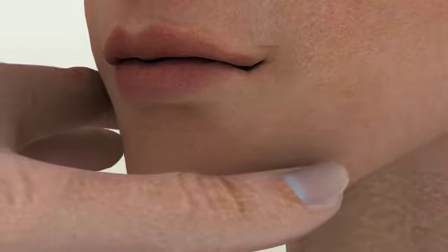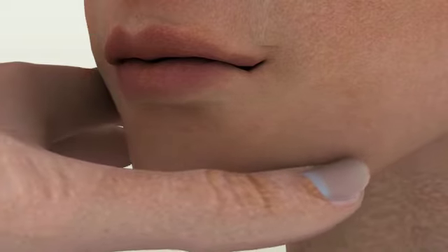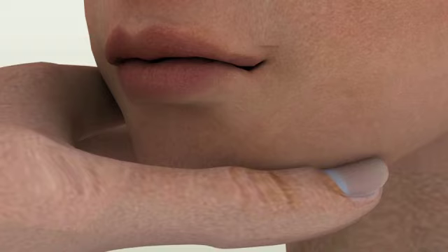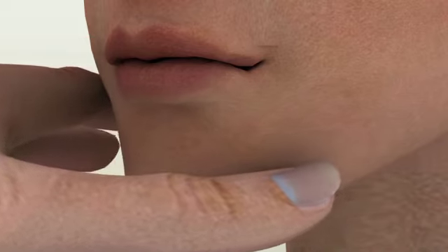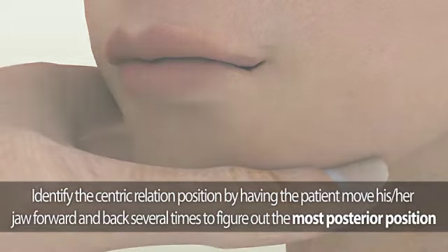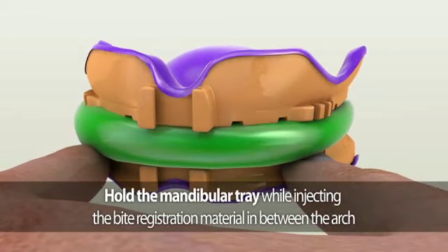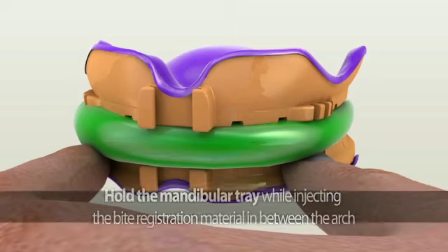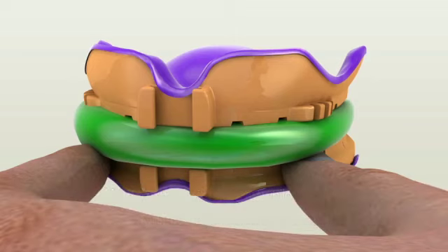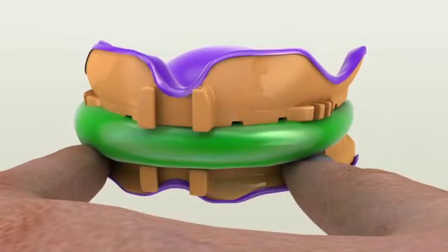Once you have determined the patient's vertical dimension of occlusion, identify the centric relation position by conducting a simple jaw movement. Have the patient move their jaw forward and back several times to identify the most posterior position. Once identified, inject the bite registration material in between the arch — this is the patient's centric relation location. After the bite registration material is set, remove the entire piece from the patient's mouth. Send these impressions as assembled right after removal, without detaching any parts.